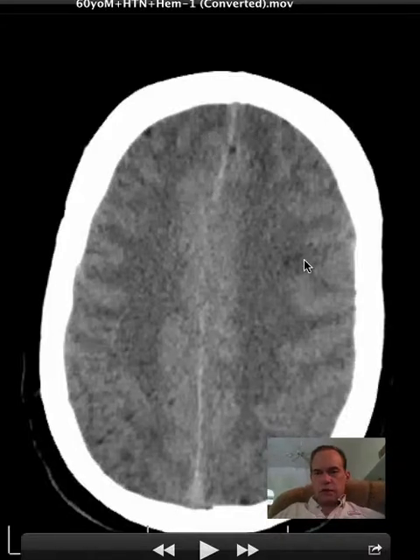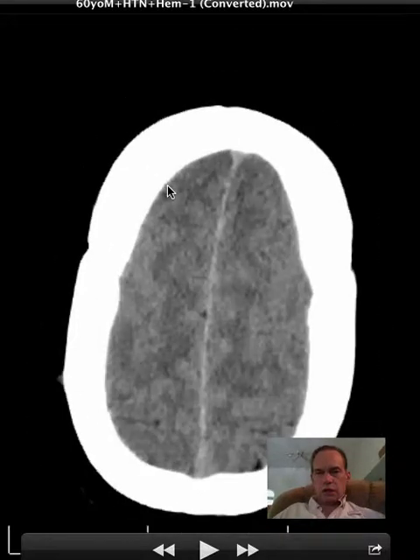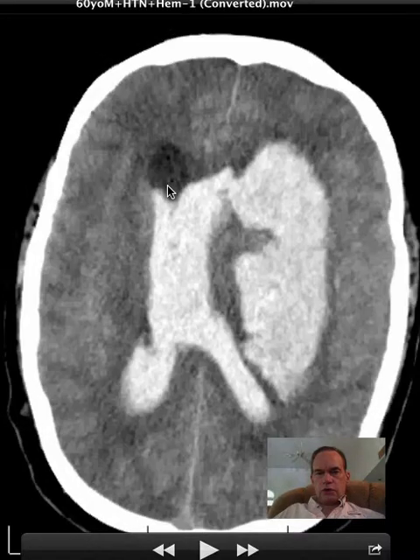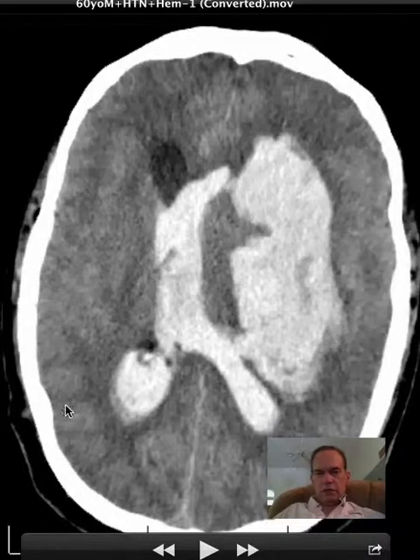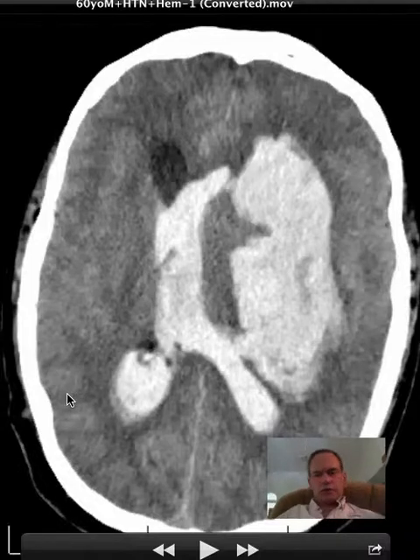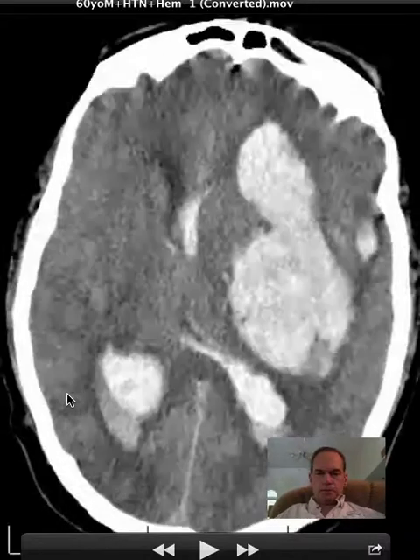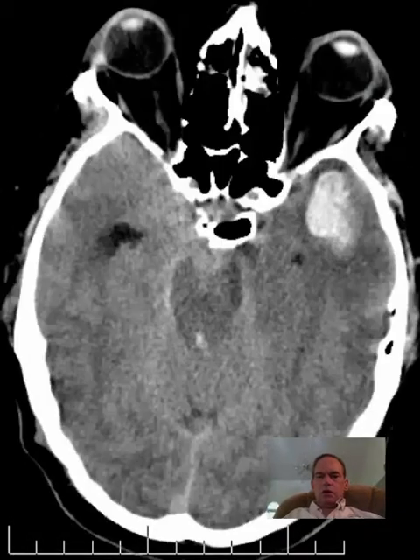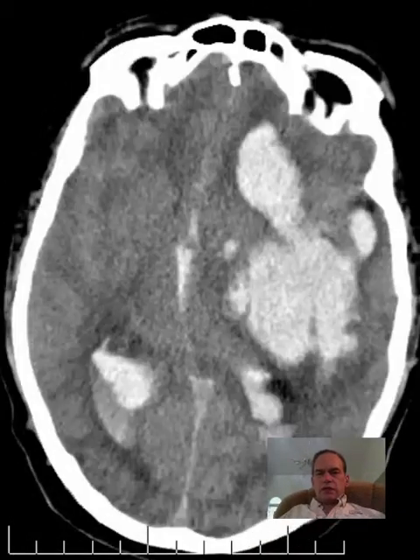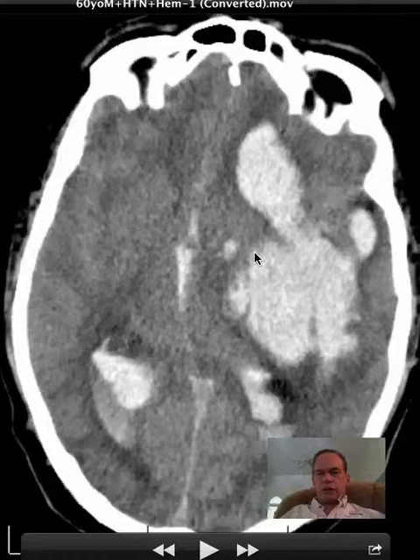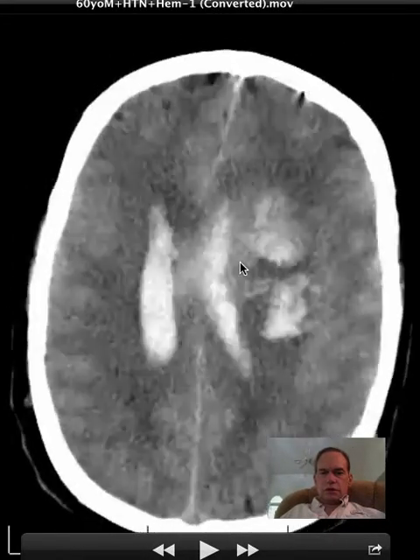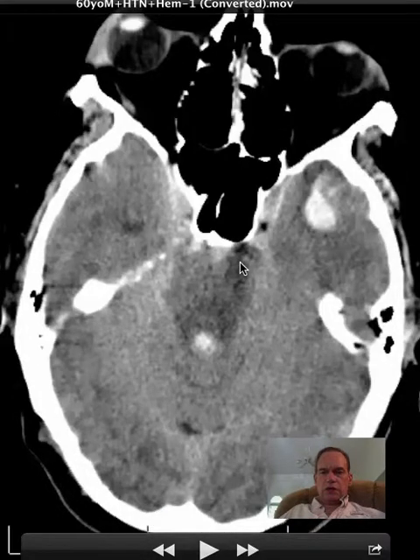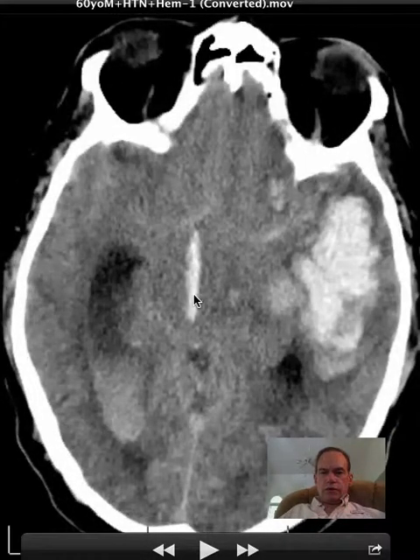You see very few cortical sulci here; you can see them at higher levels. But when you look down at these levels where the hemorrhage is worst, you see no cortical sulci, and pretty much none over the convexity of the right hemisphere as well. This is typical of a hypertensive hemorrhage centered in the basal ganglia, occasionally extending into the ventricular system — not at all uncommon — and into the third ventricle.